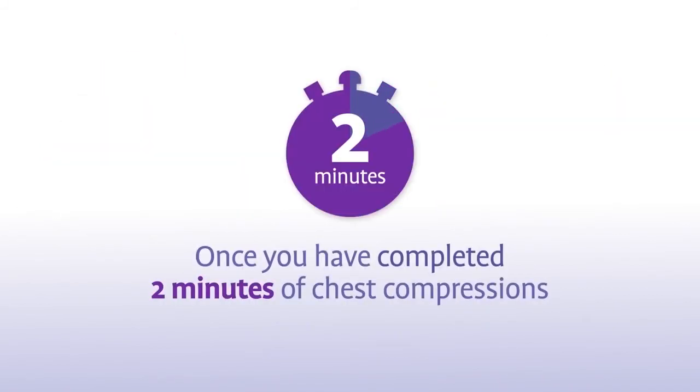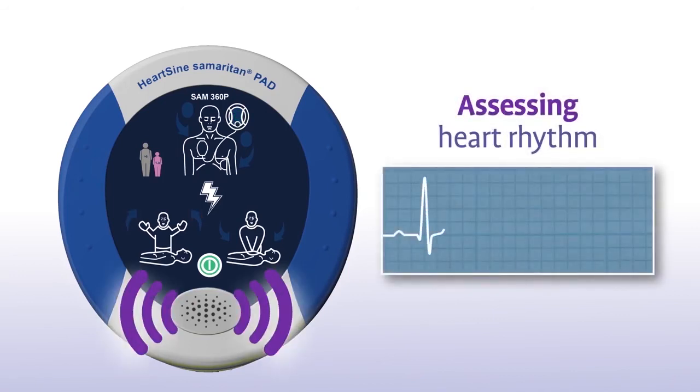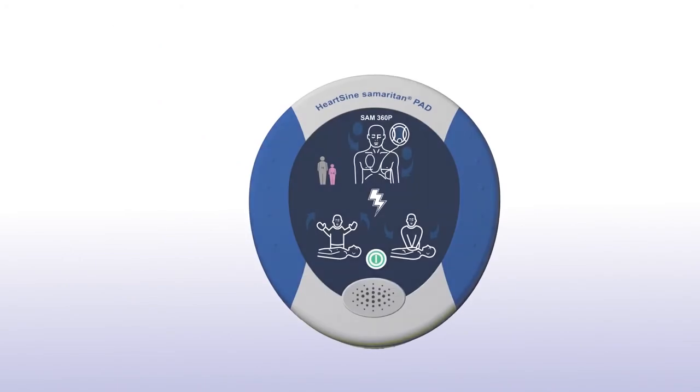Once you have completed 2 minutes of chest compressions, the Sam360P will prompt you to stop chest compressions. Stop CPR. And again, it will assess the patient's heart rhythm. Assessing heart rhythm — do not touch the patient. Sometimes no shock is needed in a life-saving situation. No shock advised. The Samaritan PAD will tell you in that instance or advise you to continue to perform CPR.